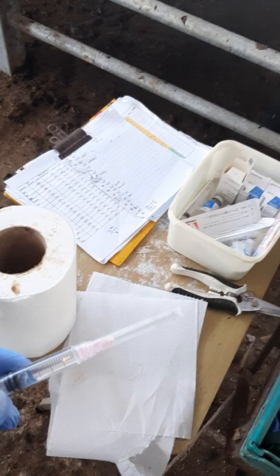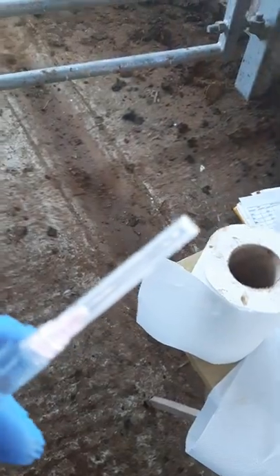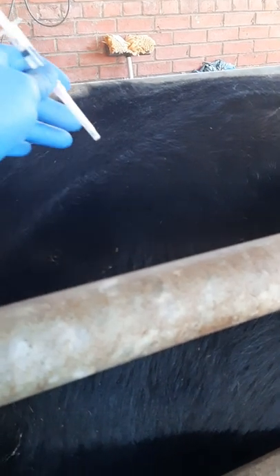2.5 mils of Receptal. I'm using a lure lock type syringe to maintain needle contact. I hate dropping needles — I hate leaving them behind in animals. For this job it makes it a lot quicker. Straighten the deep muscle. 18 gauge inch and a half needle. They hardly feel it.